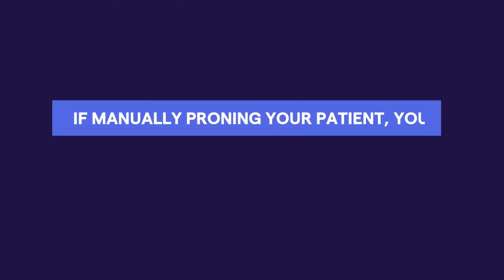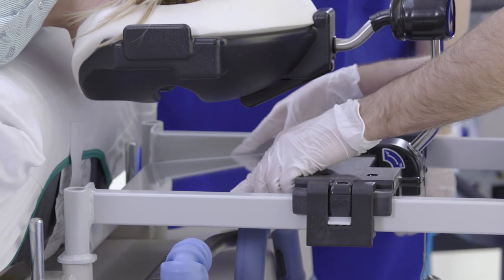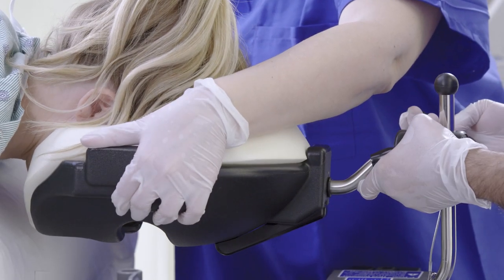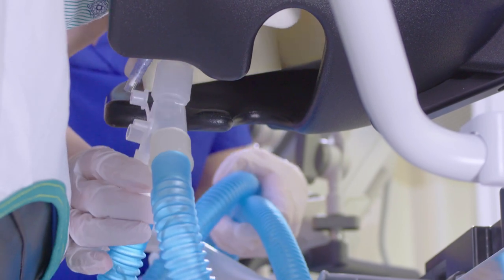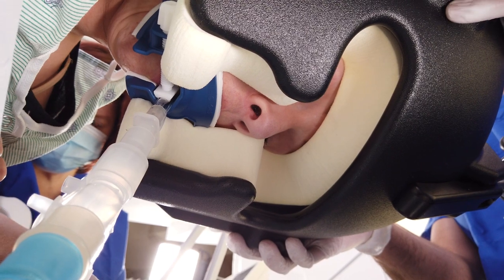If manually proning your patient, you'll need to pull the patient towards the head end of the bed. Once your patient is comfortably placed in the accessory, you can make additional adjustments as needed for maximum patient comfort and caregiver access. If your patient is intubated, guide the tubes into the face cushion and head support opening during patient adjustment.